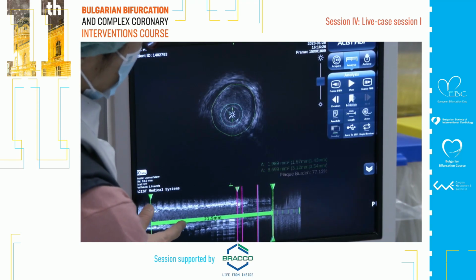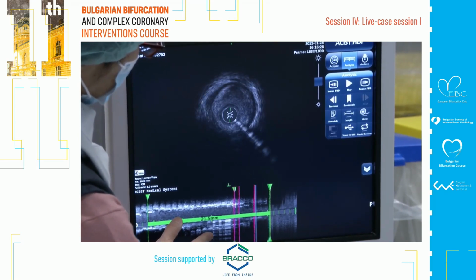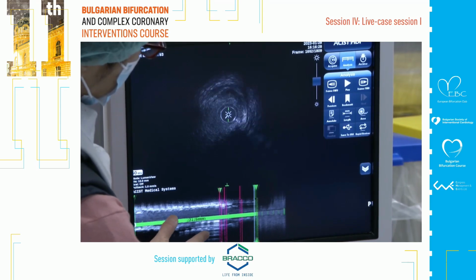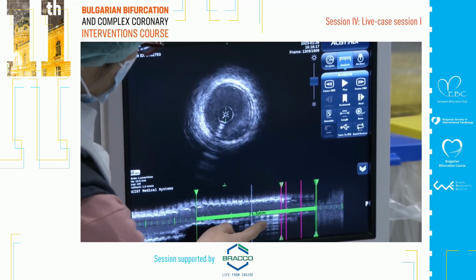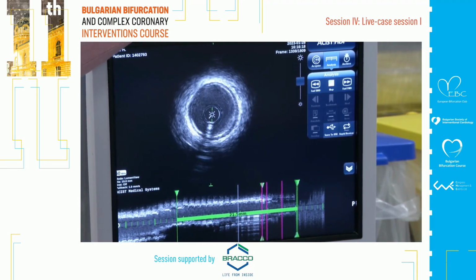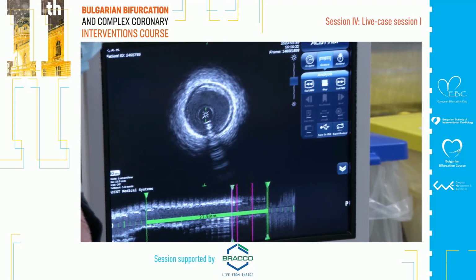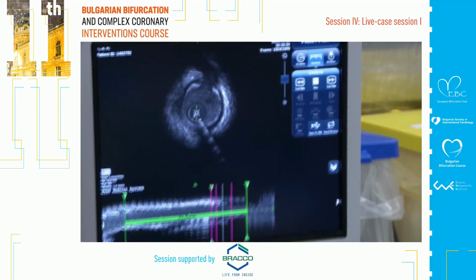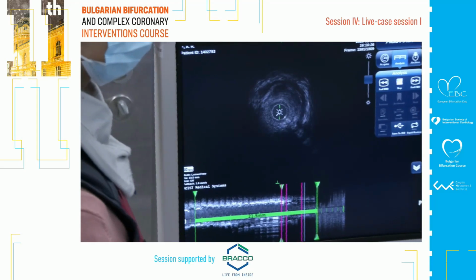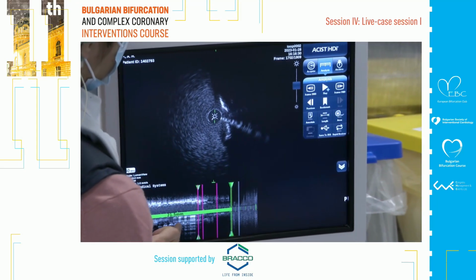What do you think in the panel? We should go for cover up to the older stent, or we just cover the ostium and that's all? I still believe in focal stenting. Dr. Nair, what length are you going to use for the ostium? 8 or 12? Because from the lesion itself, it was about 6 millimeter.